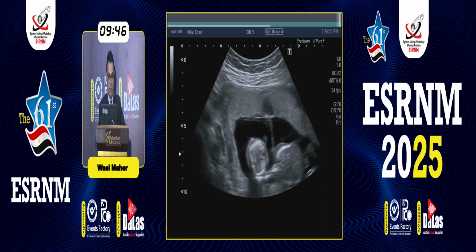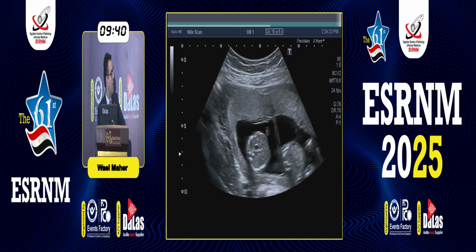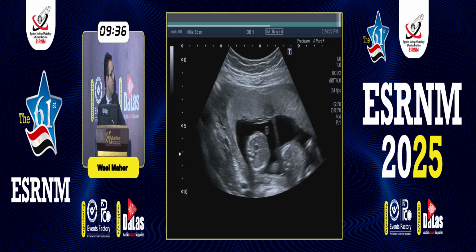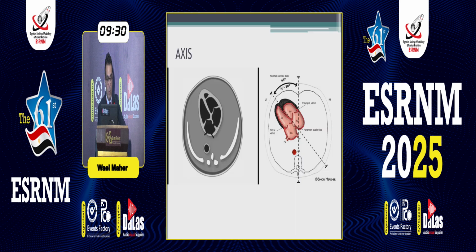So here we have a dextro condition. That's even in twins. If you can see here, twin number 1, you can see the gastric bubble, the hypoechoic circle here. It's on the left side and the apex is on the other side, and unfortunately she aborted the twins for this because she had multiple other anomalies.